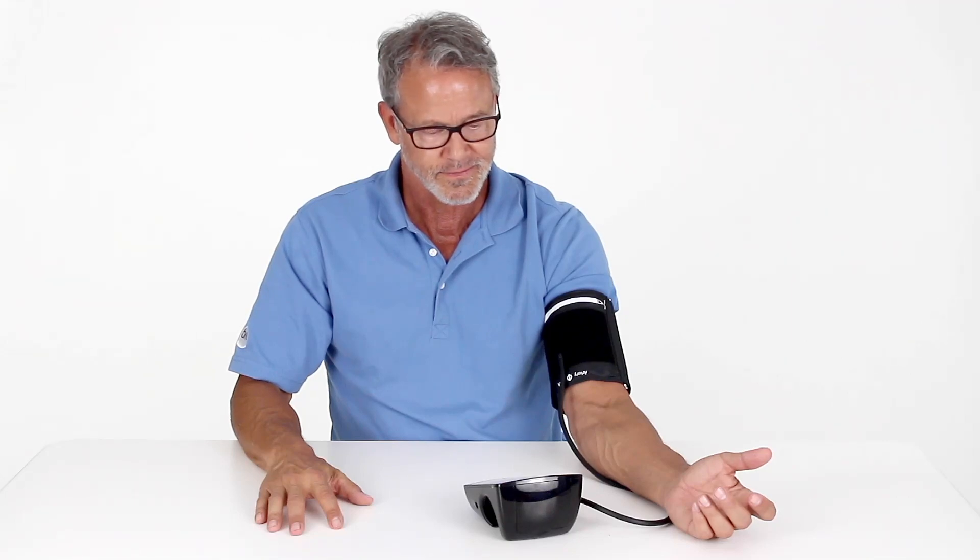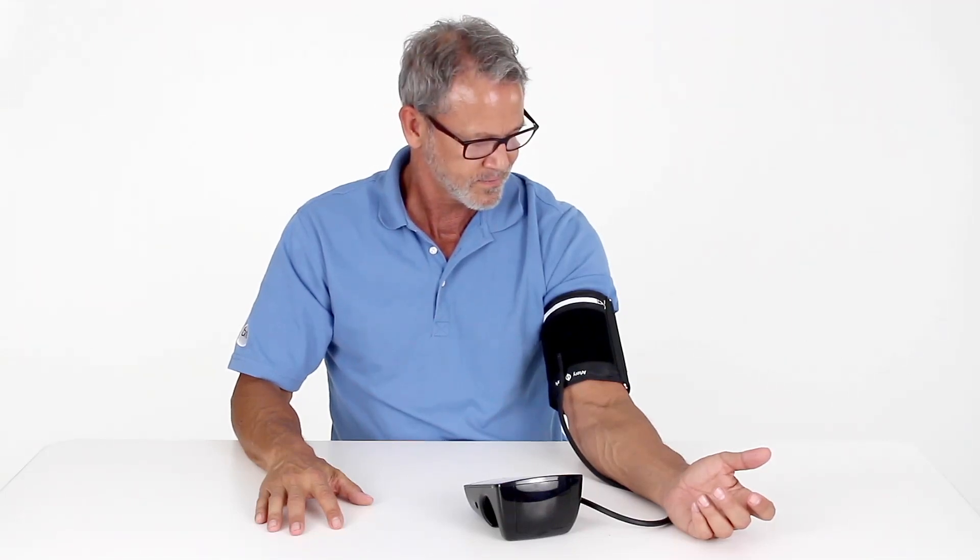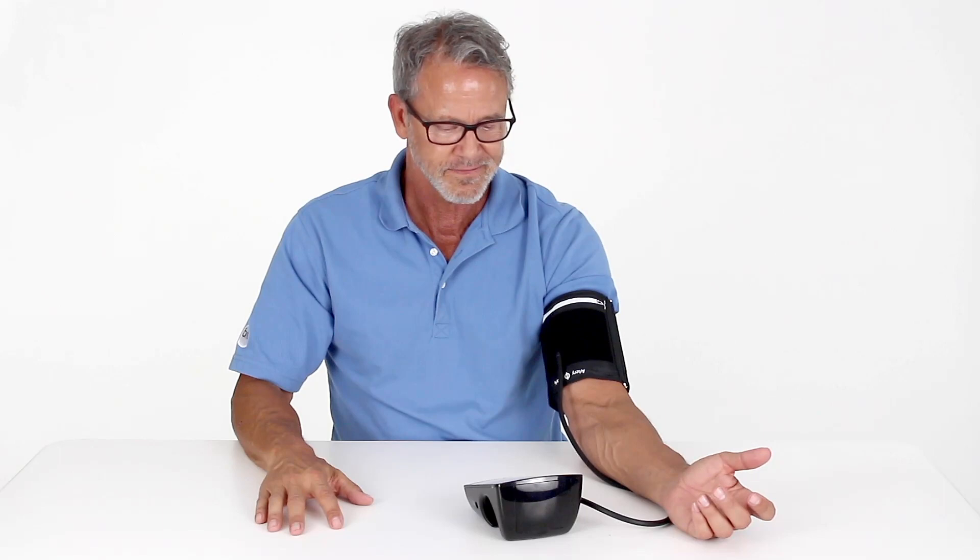While taking the measurement, do not talk or move. Simply remain calm and relax for the duration of the measurement.